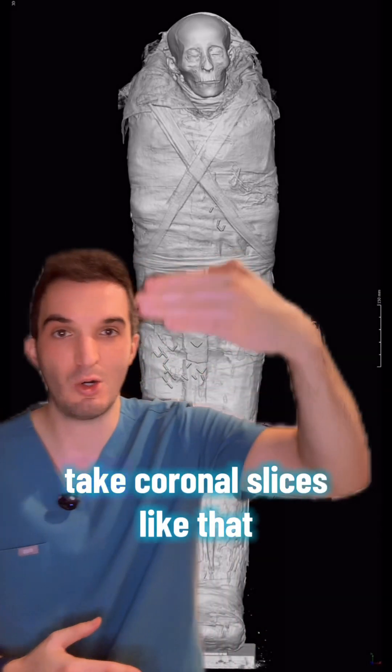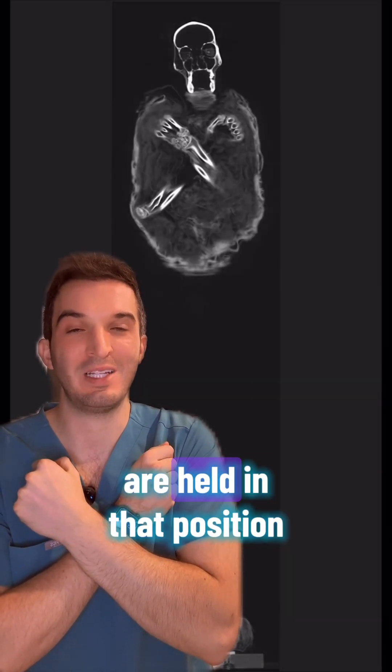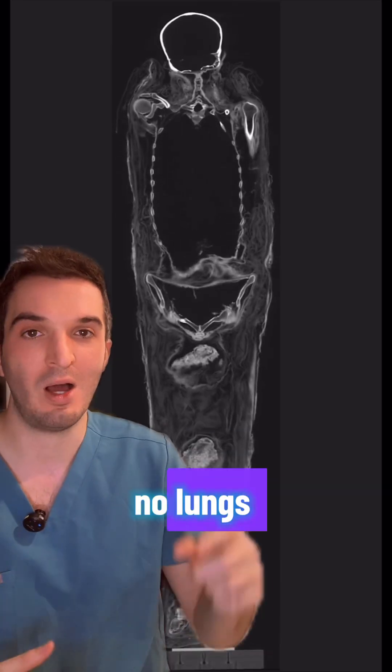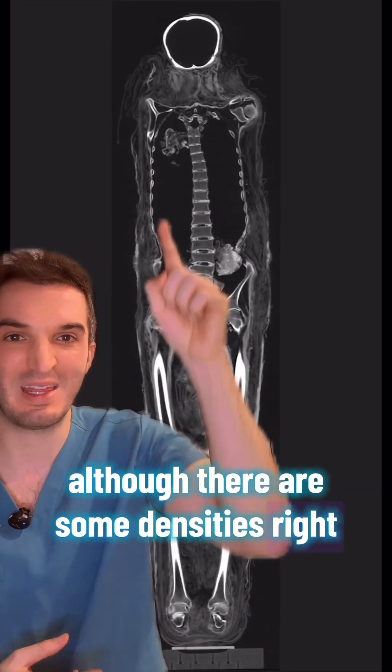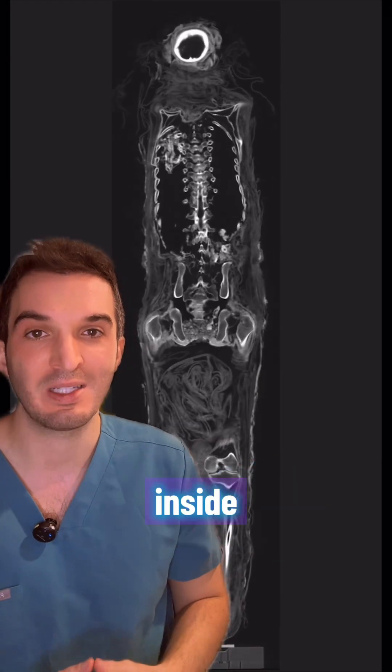The cool thing is when we take coronal slices, you can see the mummy's hands are held in that position, just like how they look on the sarcophagus from the outside. Again, hollowed out, no lungs — although there are some densities right there and right there; I'm not completely sure what that is. It might be packing material that got inside.